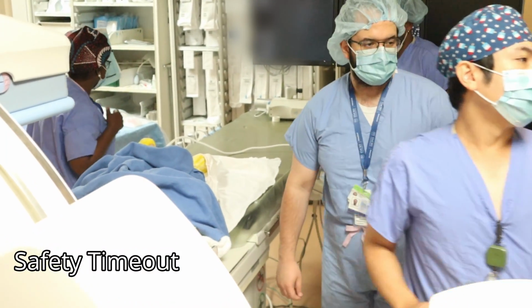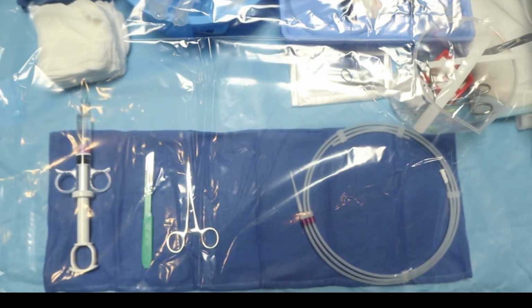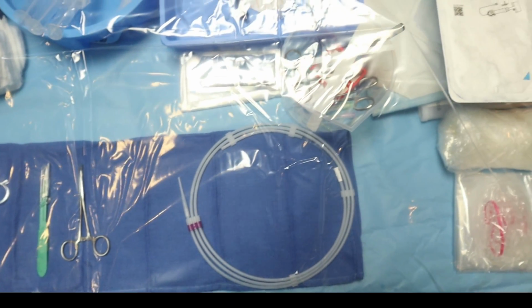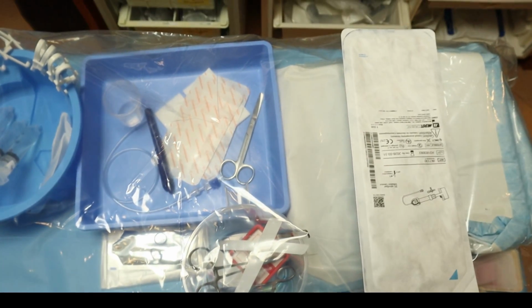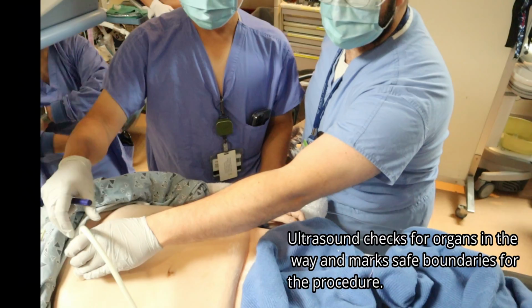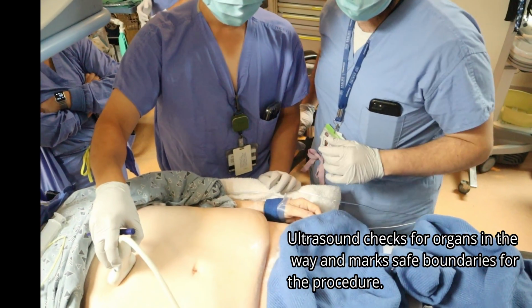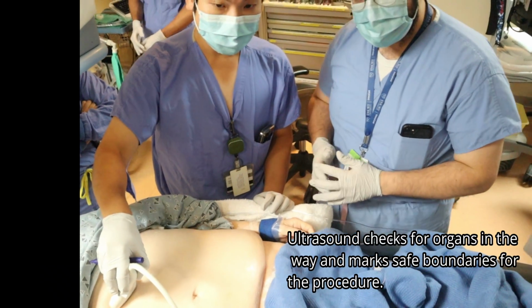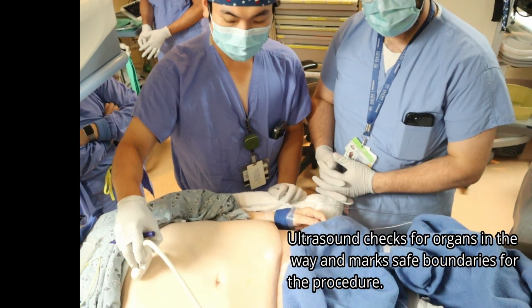Now, Dr. Park will show us how he uses ultrasound to confirm that the procedure can be performed safely. With the ultrasound, he marks the edges of the liver and rib cage, establishing safe boundaries in which to work. Before we prep, although we did look at her pre-procedure CT imaging, making sure that there's no liver or bowel loop in front of the stomach, we're going to still mark the liver.